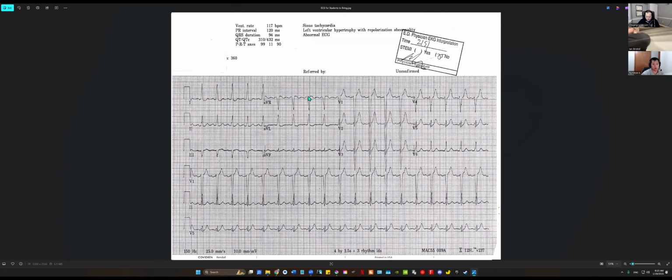Just like a 4 by 3 grid, 4 across and 3 tall, and then inside the boxes, label them lead 1, 2, and 3, kind of like the EKGs. We're going to fill this in together.